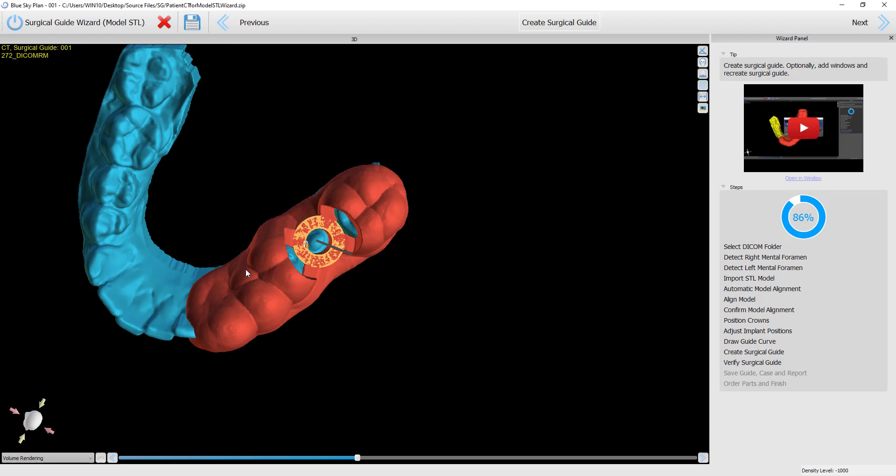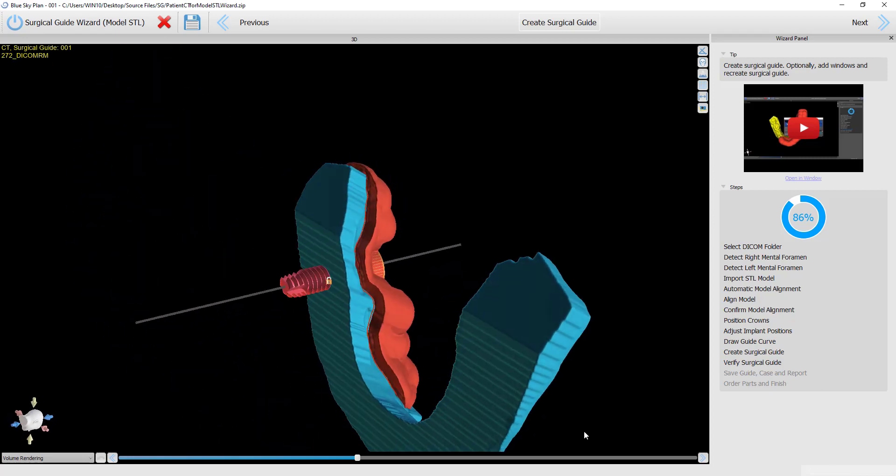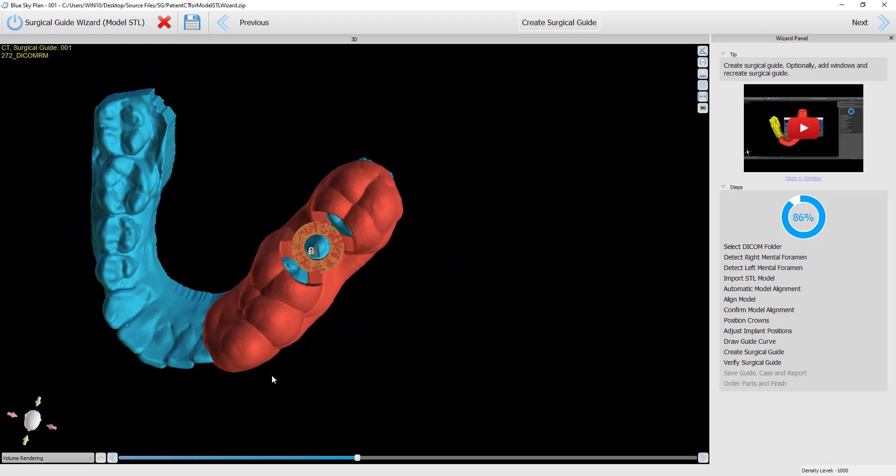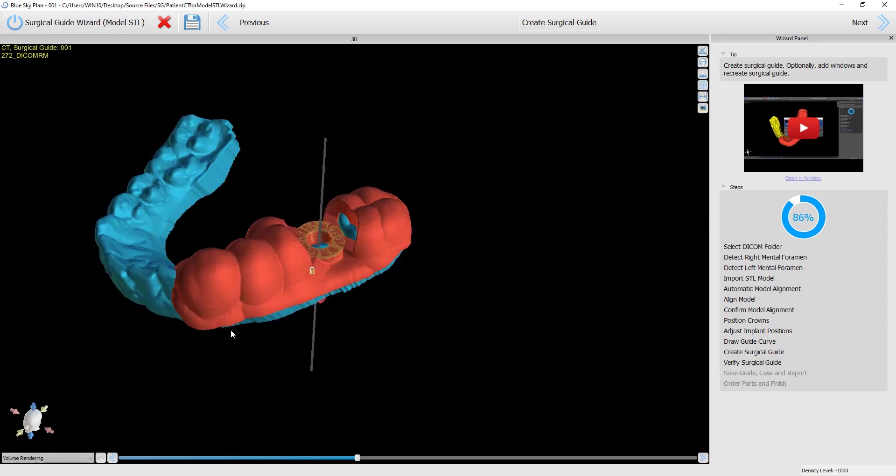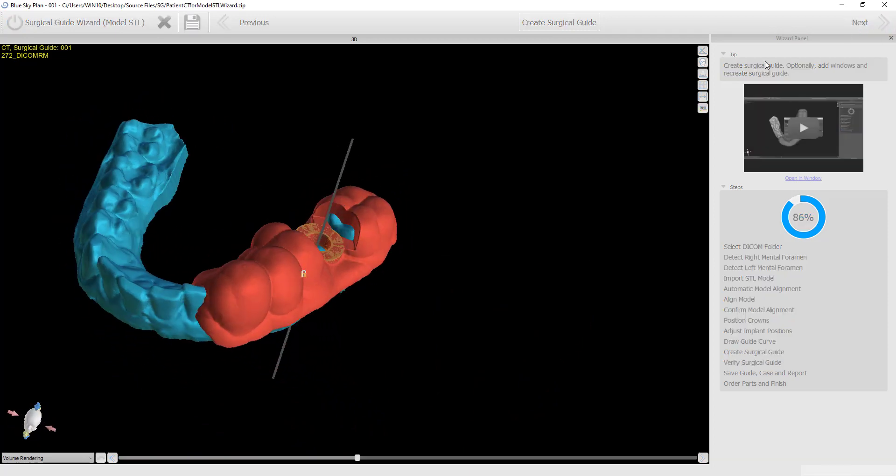The surgical guide is prepared and visible on the same model with the undercuts removed, showing that the guide was fabricated with those undercuts removed.